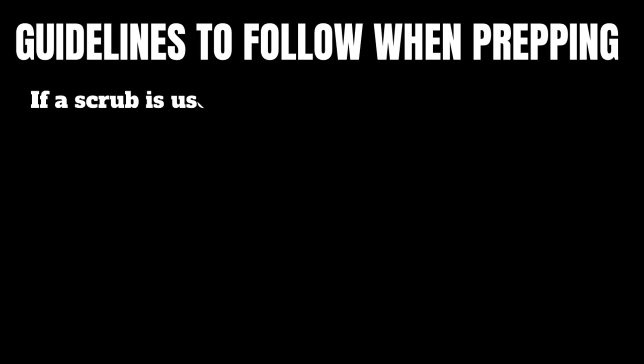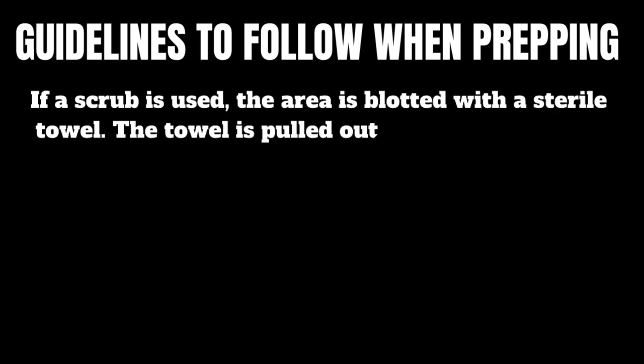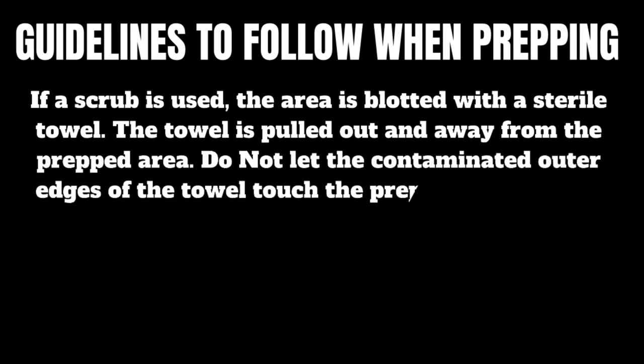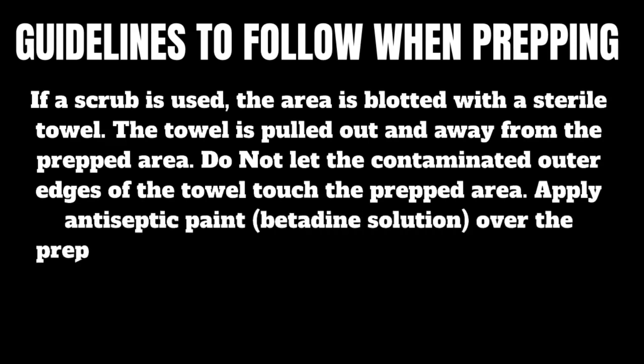If a scrub is used, the area is blotted with a sterile towel. The towel is pulled out and away from the prepped area. Do not let the contaminated outer edges of the towel touch the prepped area. Apply antiseptic paint, Betadine solution, over the prepped area.